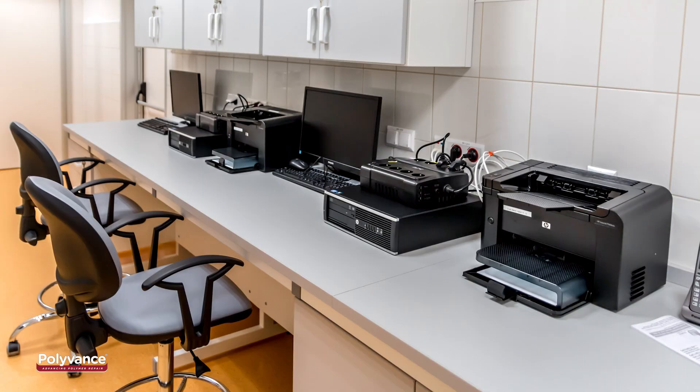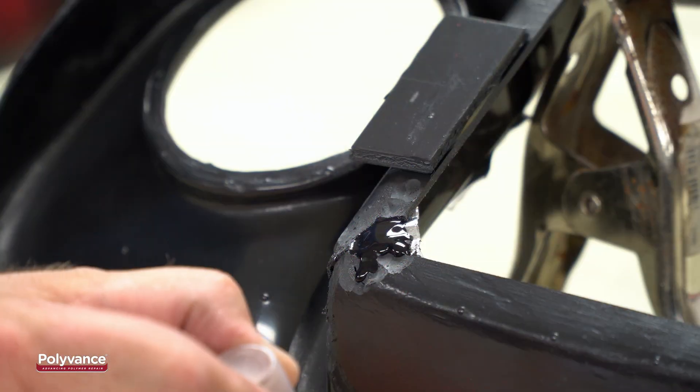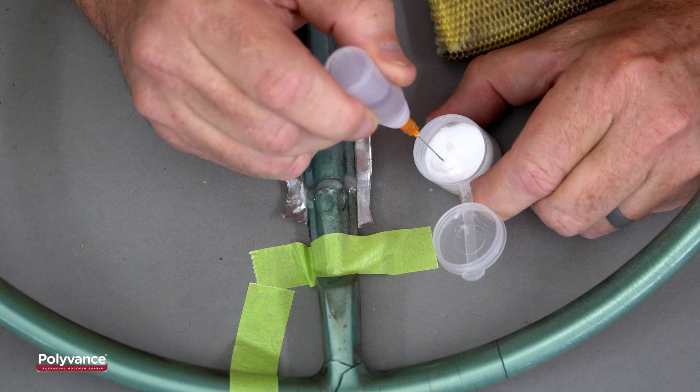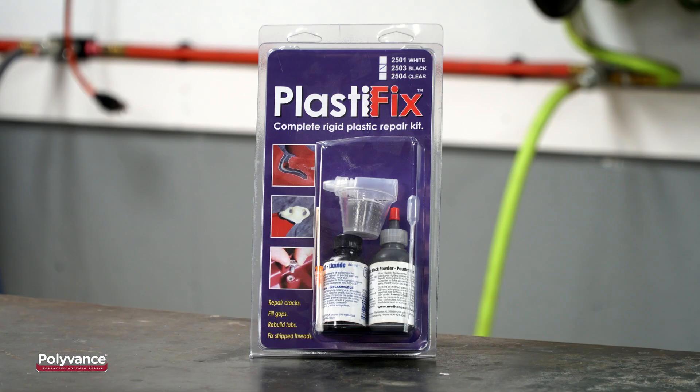Many household items, office machines, and medical devices are made of a rigid plastic called ABS. This type of plastic is easy to repair by a variety of methods, but the most easily accessible method for the do-it-yourselfer is Polyvance's PlastiFix Rigid Plastic Repair Kit.